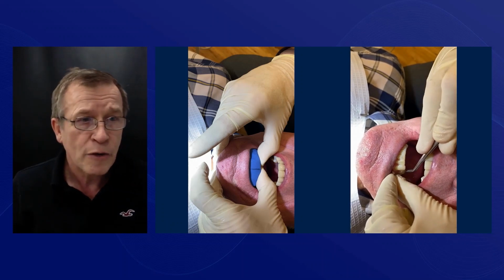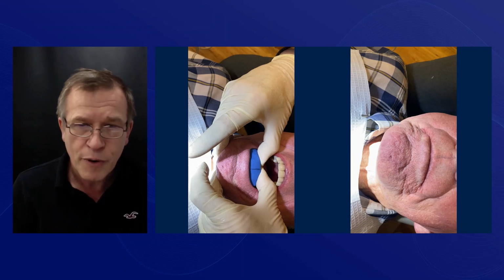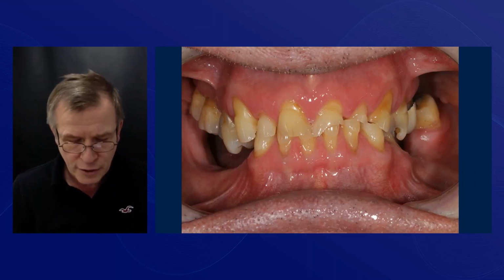Now, digitally, we can move forward with these things very, very simply, very, very quickly, and very efficiently and cost effectively. So we can take Gordon from here to here in maybe 5-10 minutes. And then we get to see how this looks in the patient's face. How does he feel about it? We can see exactly the changes that we've made.